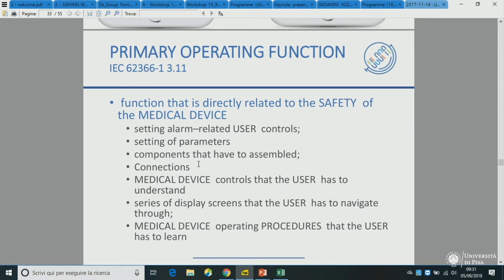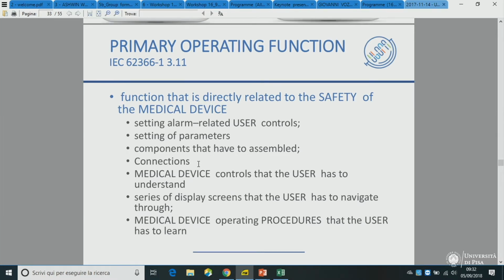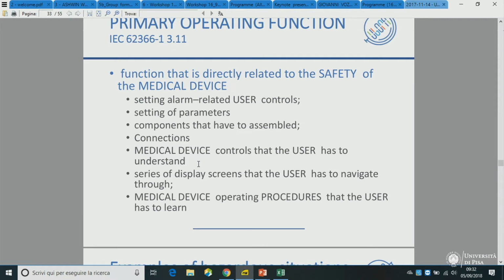This is a very stupid medical device interface, because if I set a core value, I expect the alarms just to reset in an interval, right? I'm not expecting to be the one who has to force the alarms to go around the core setting. So it was a very stupid mistake in usability, and a safety-related mistake in usability.